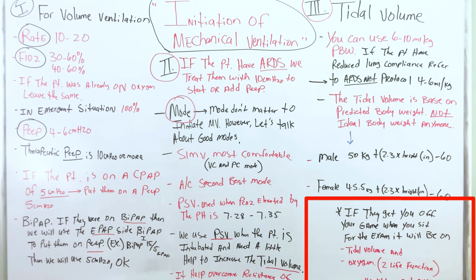Now, if they get you off your game when you sit for the exam, it will be on tidal volume and oxygenation. You know why? Because these are your 2 life functions: ventilation and oxygenation. When you're setting up the patient on the ventilator, always know that you have ventilation and oxygenation intact. And there you have it.